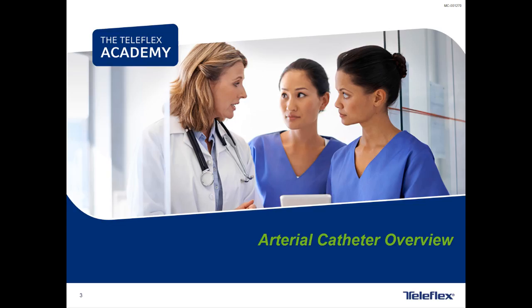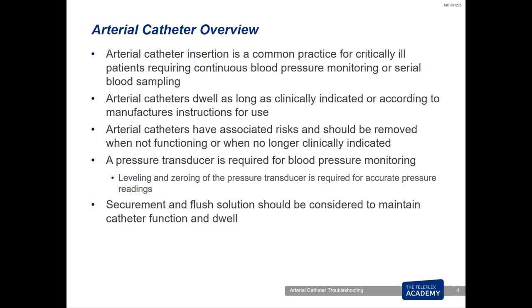So first, we really want to do an arterial catheter overview. Arterial catheters have been used for many years in the critical care environment. We practice blood draws, continuous blood pressure monitoring, and serial blood sampling in a very critical element within the hospital. Arterial catheters dwell as long as clinically indicated or according to manufacturer's instructions for use.